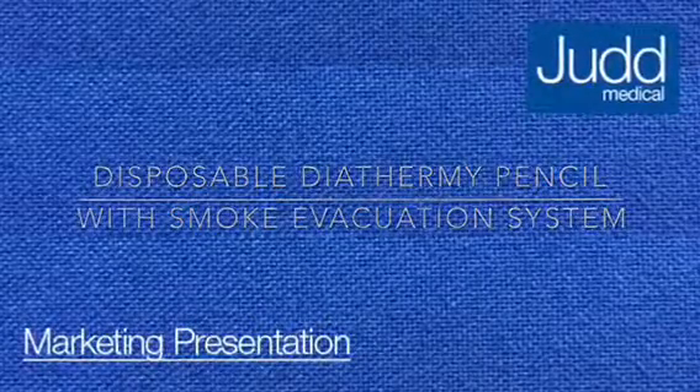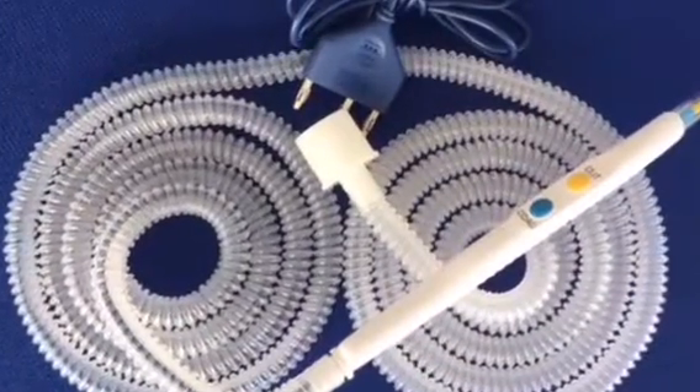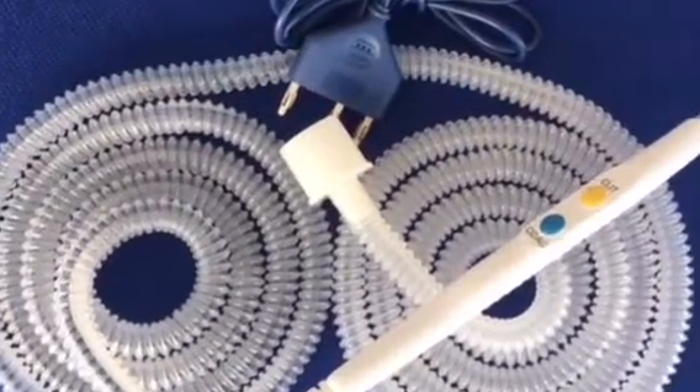Using a smoke evacuation system, in addition to room ventilation, is the first line of defence against surgical smoke exposure.